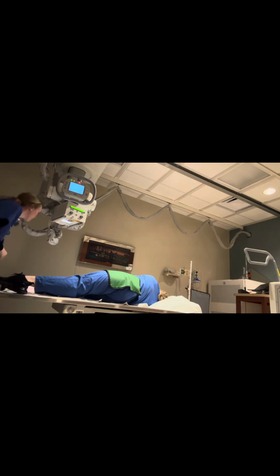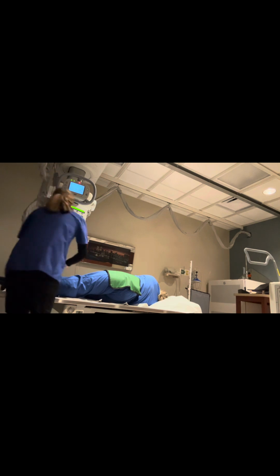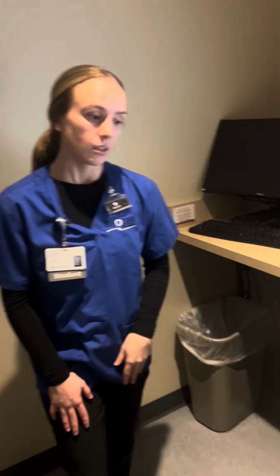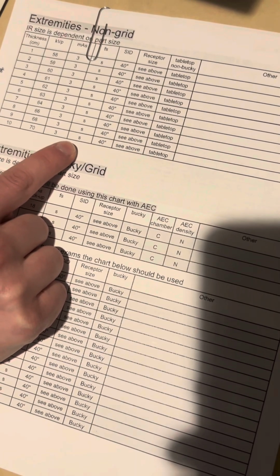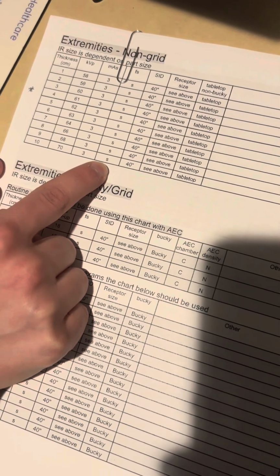And then I'm going to measure her part to get the correct thickness to set our exposure factors. Looks like she is at 10 centimeters for the lateral as well. Now that I'm behind the lead-lined wall again, I'm going to set the exposure factors for the lateral projection. So we're going to look at this chart. She was 10 centimeters again, 70 kVp, 3 mAs, and then a small focal spot again for this one because we are looking at bony detail.